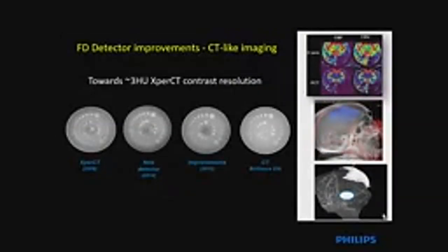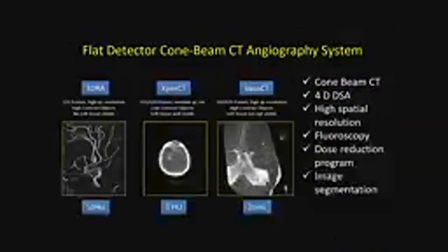Regarding what is happening in the imaging world, you heard cone beam CT. These are the most recent detectors. We work with Philips, but Siemens is going the same path. I think that working on equipment with the highest capability of doing cone beam resolution is important. So what do we use in spine? Like in the brain, I have an example of the brain here. We have the 3D rotational angiography.